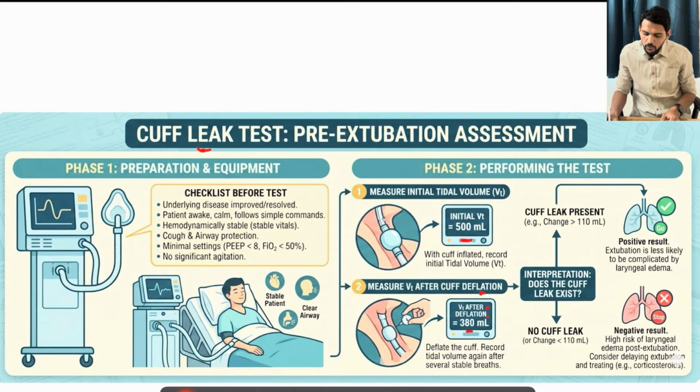The change should be more than 110. That will indicate there is cuff leakage. So it should be there. Cuff leak test should be positive. That is, cuff leak should be present so that we can proceed with the extubation.